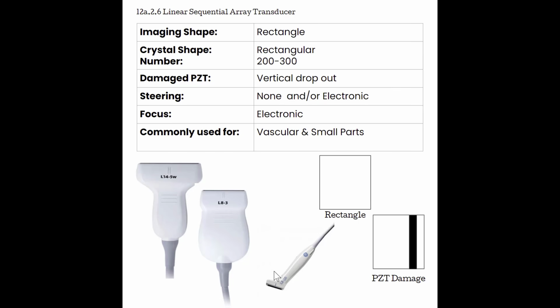This little guy here is called the hockey stick, and it has a super high frequency. It goes all the way up to 18 megahertz. So this type of transducer is really, really awesome for superficial skin structures. We can also use this for some very small vascular structures. Use this quite often for dialysis mapping. Use this quite often in pediatrics because their vessels are so tiny that we want to see them well. So we have options within all of our transducers as far as frequencies go.